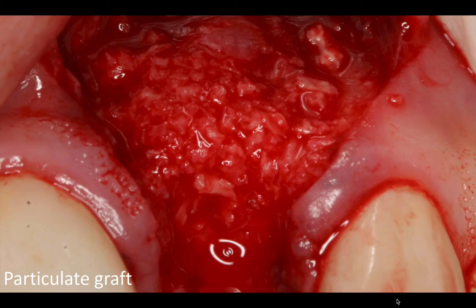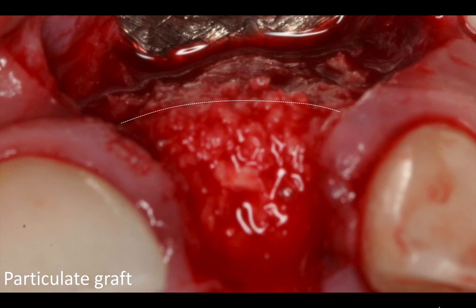So my preference is to graft the socket with particulate bone, in this case an allograft material, where I'm going to be filling the defect, as long as there's good vascularity, which you can see there is, to the fullest contour of the original ridge. And if I had the chance to redo this case, I would probably overgraft.